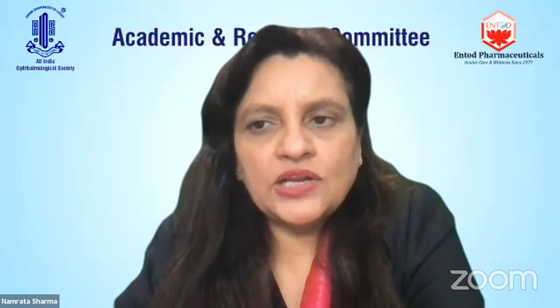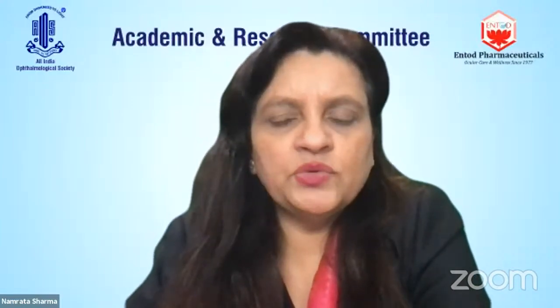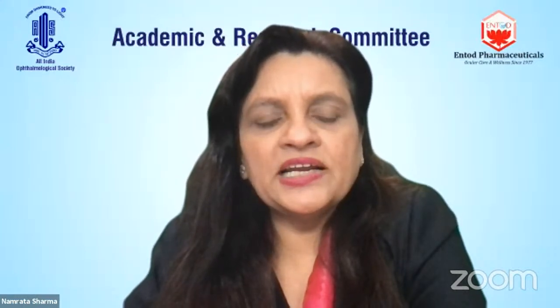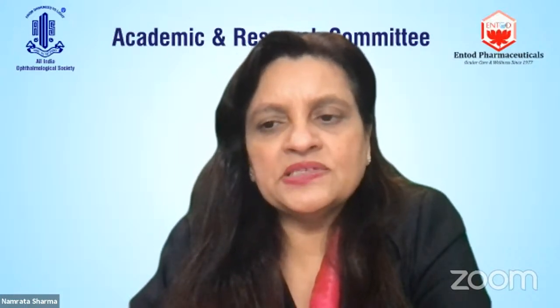And the second thing is that I would rely more on the cohesive viscoelastic if I see a zonular dialysis, rather than a dispersive one, because that would also expand the bag. Endocapsular ring, you showed it through the side port, but like you said very rightly, we would use it earlier rather than later. And I would do it through the main port itself. And you did implant this kind of intraocular lens, but I would probably have done a 3-piece IOL, because the zonular dialysis was large. Although the endocapsular ring did take care, and I'm sure post-operatively it would have been okay, I would be happy to use a 3-piece intraocular lens.